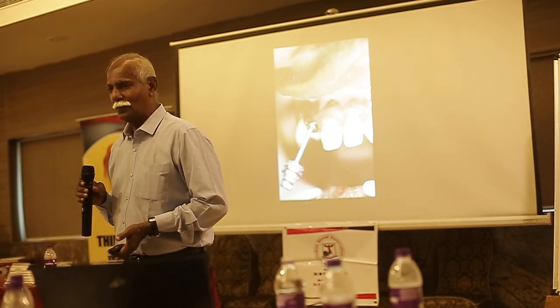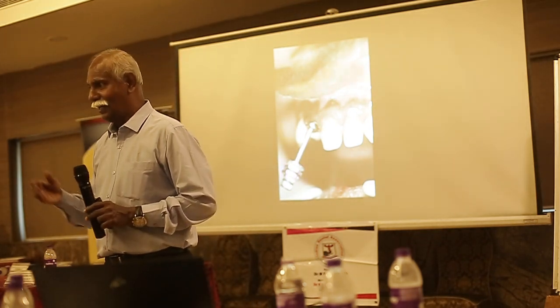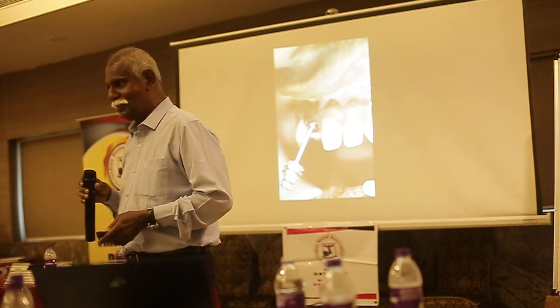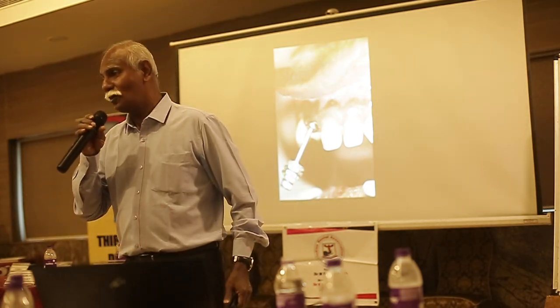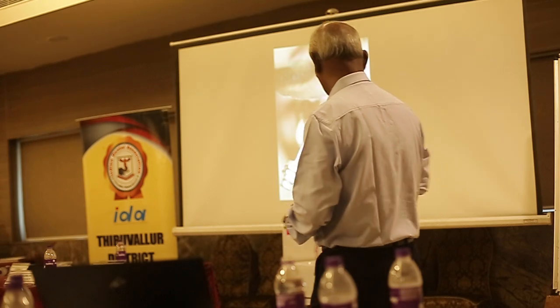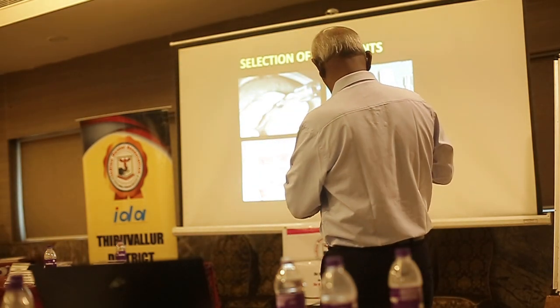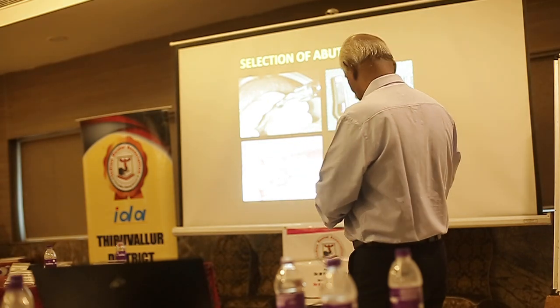For a guide you need to spend at least 3,000 rupees. You have beautiful eyes and a good brain to assess what it is, so why do you need something? The guides are meant for the blind. I'm sorry for my language. So we have various abutments, straight abutments and angulated abutments.